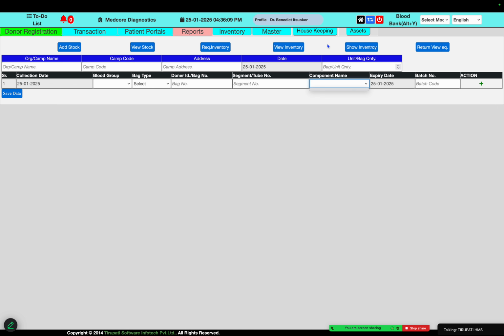Similarly, you would like to do bulk supply for blood banks, right? Currently, this kind of bulk supply we have not defined in the system. Actually, we do supply on a one by one patient record basis, like that. So no worry.